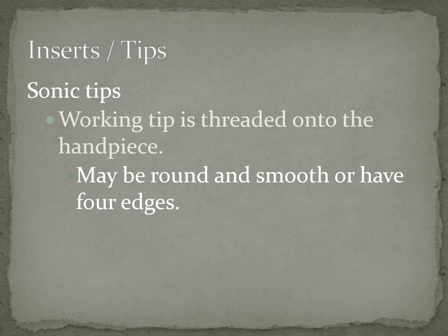The working tip for your sonics is just going to be threaded onto a handpiece. It may be round and smooth, or it may have 4 edges, but like I said, you're very limited to the tips you can have with those. And so we just don't really use sonics very often when we have the capability of using ultrasonics in the clinic.